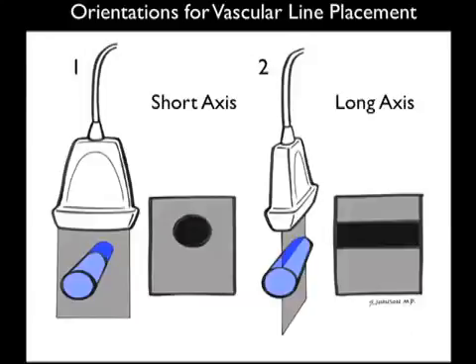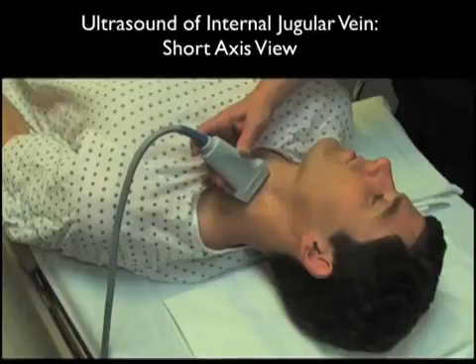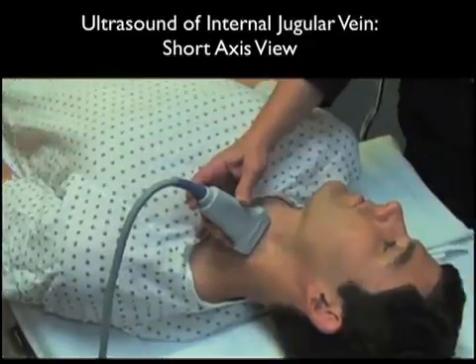To the right, we see the long axis configuration, and note the probe placed along the long axis course of the vessel. The vessel, therefore, on the screen will appear as a tubular structure, as shown here in the image to the right. Here's the high-frequency linear type array probe placed over the middle triangle of the neck, over the internal jugular vein and carotid artery.